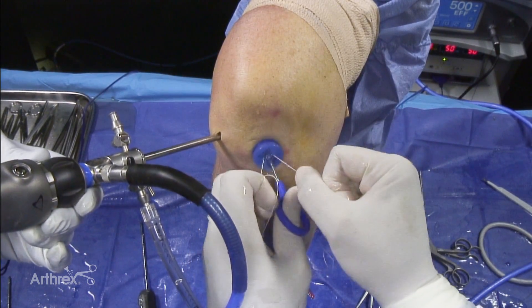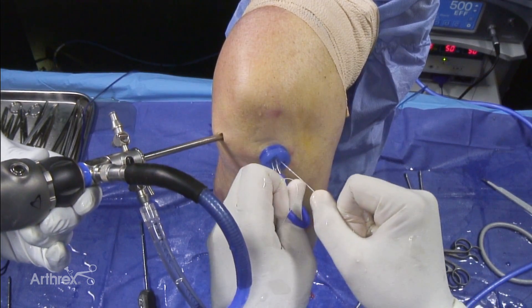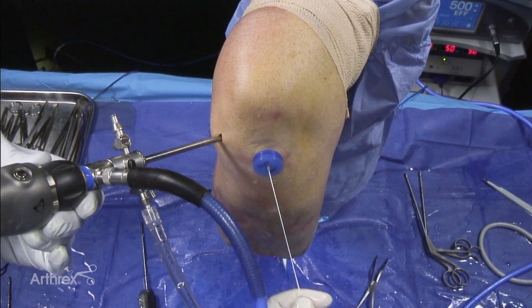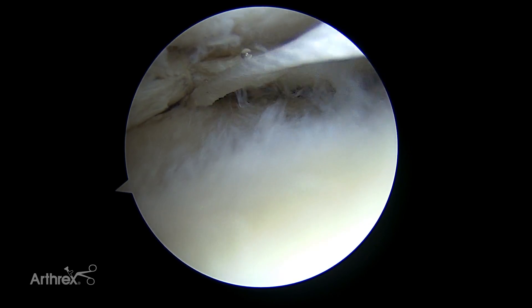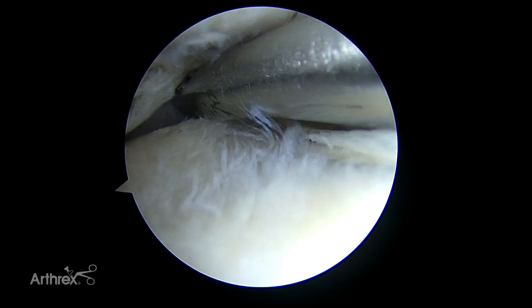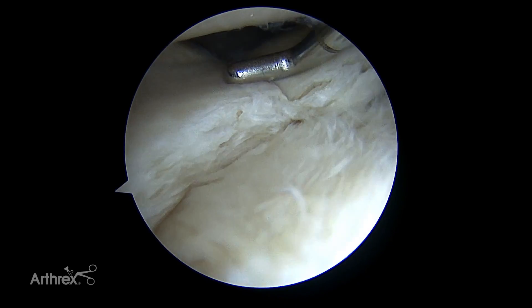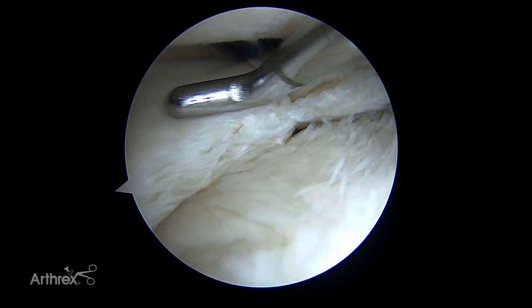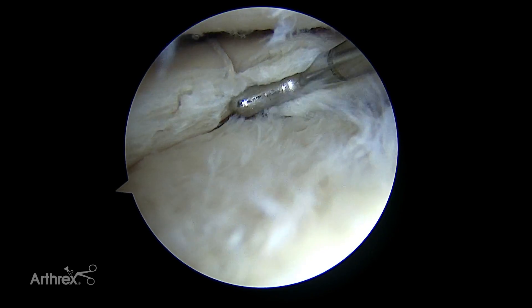Once I do that, I can pull on the opposite limb and this will cinch my stitch down. We'll go in with our curved 2-0 fiber wire cutter. I can still push my knot down a little more and then cut it. This gives us a nice circumferential stitch, and then we can pass additional stitches anteriorly and posteriorly for a nice repair.